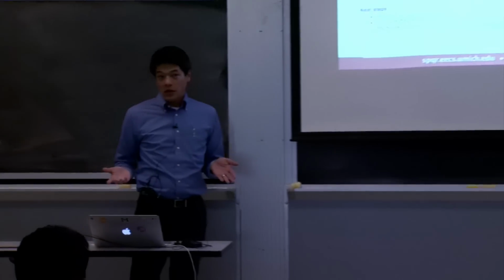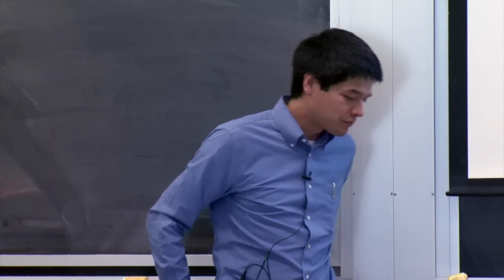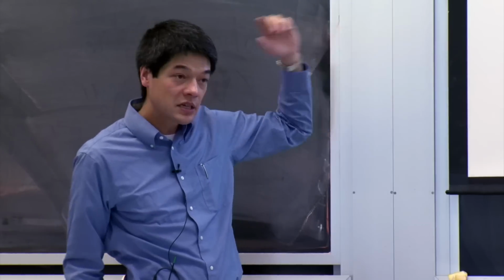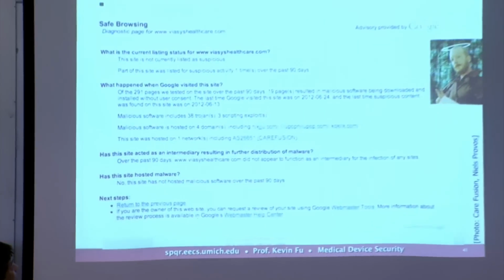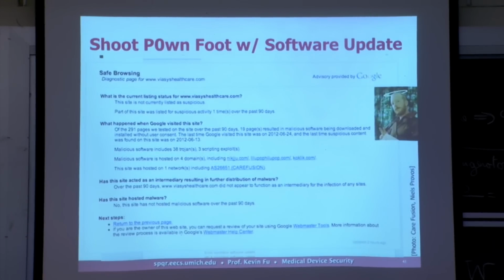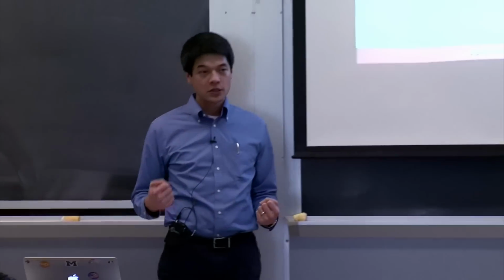So this is what you might call drive-by downloads. It's a very common way of getting malware today on the internet, especially with the spammers and some of the organized crime. But in this case, their website appears to have been infiltrated. Instead of sending me the ventilator software update, they were giving me malware. And at least according to the Google website, over the past 90 days, that's what the website was resulting in. So all I could think was, if there's an FDA recall and you're a biomedical engineer working for a hospital and your job is to keep your hospital medical devices safe and effective, you're going to go download that software.